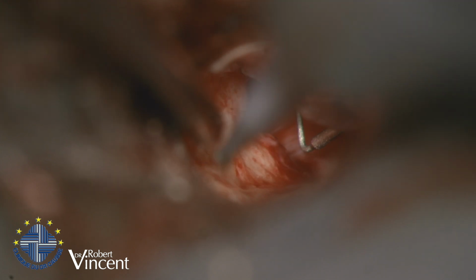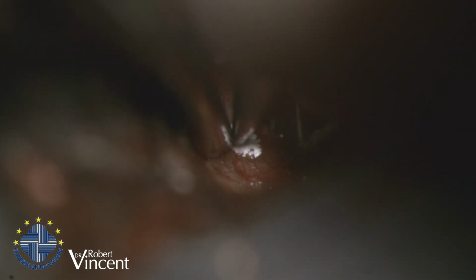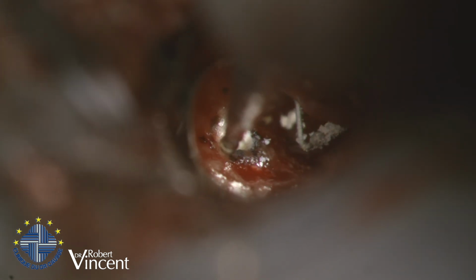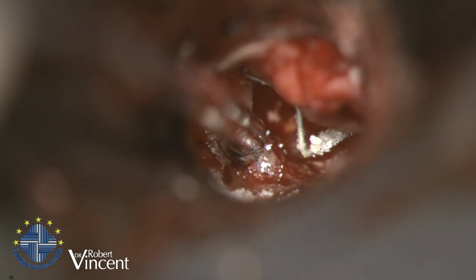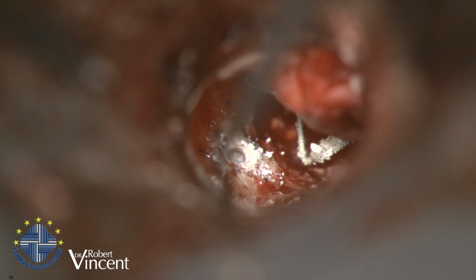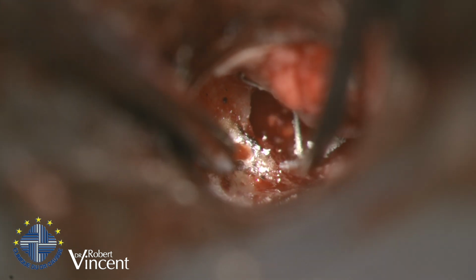Okay, so using 0.4 millimeter, 0.6 millimeter, 0.4 millimeter. No, it's a 0.6. Sorry, 0.6 millimeter burr. Ok, un peu de sérum s'il vous plaît. Pretty thick bone, eh? There we go, now it's fine. Cannez s'il vous plaît. So have a hole, eh? Completely whole here, so it's fine.